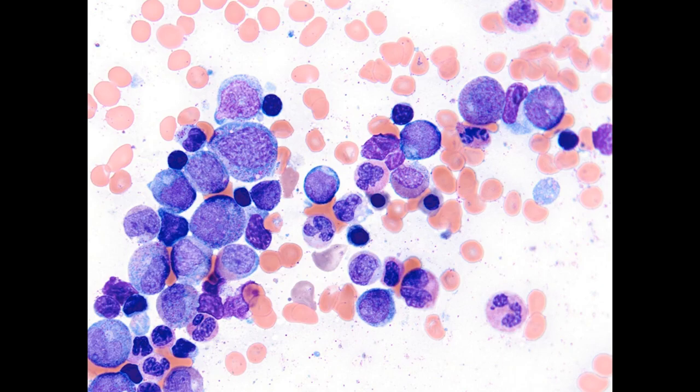Here's her bone marrow that came out several days later, and superficially this looks like pretty normal myeloid maturation. You have immature myeloid cells, somewhat more mature myeloid cells, as well as some neutrophils, but there are occasional blasts in the background, and there's some dysplastic changes within the granulocytes.